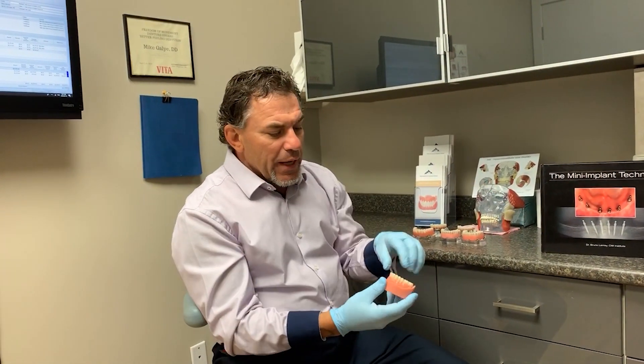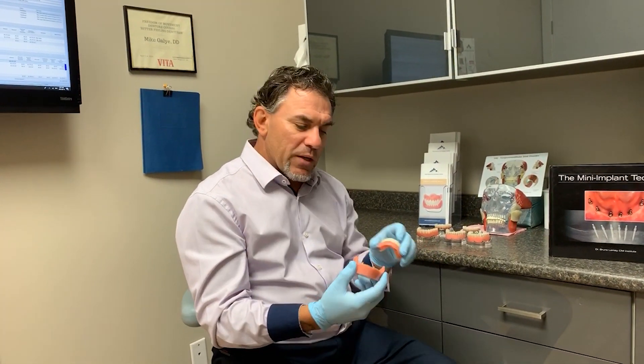One of the staple implant systems in the marketplace that most denturists use today is called Locators. It's an easy system that's been around for several years. When they first came out, we did a lot of cases. The biggest complaint was patients saying, 'Mike, when I open my mouth, the front of my denture lifts.'